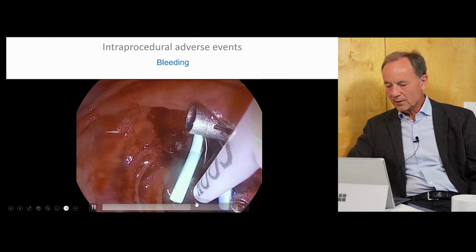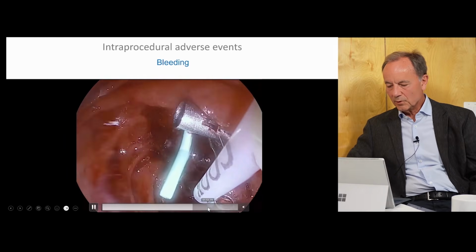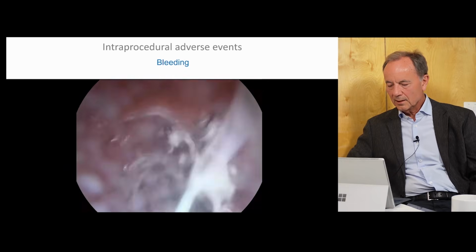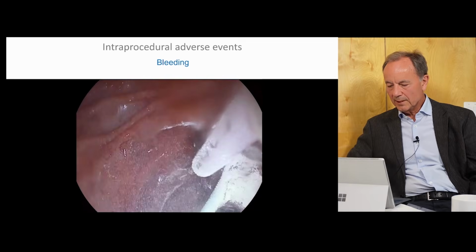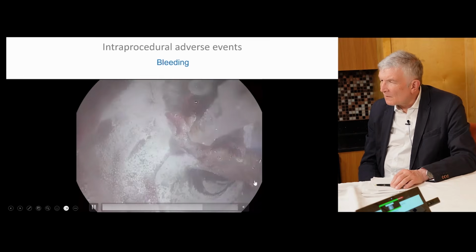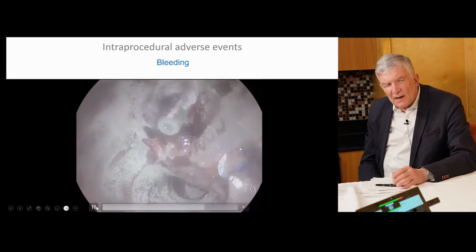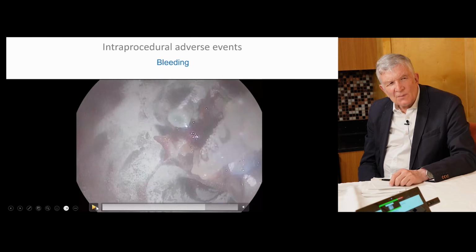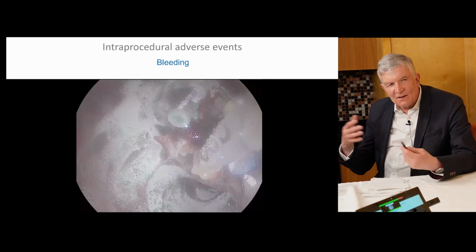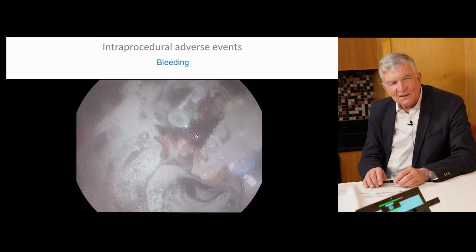So in this particular case now, I use a hemostatic spray here, Hemospray, to minimize the risk of delayed bleeding. Well, I think often there can be nasty bleedings, not severe ones, but they go on a little bit here, a little bit there, and you have to avoid that it looks like a battlefield at the end.